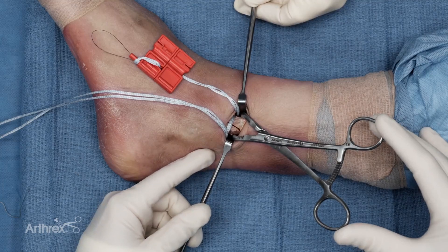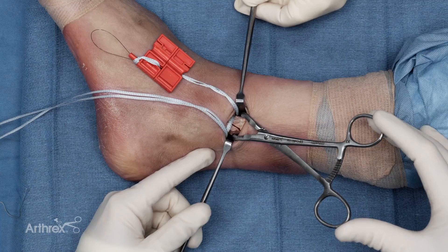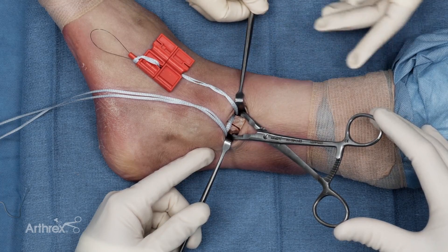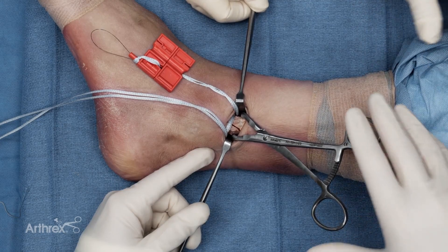Anatomic reduction has now been achieved of the fracture site. Note that there is still a gap here in this cadaver model secondary to the kerf of the blade used to make the osteotomy, but in real clinical practice this should be an anatomic reduction with direct compression of the fracture site.